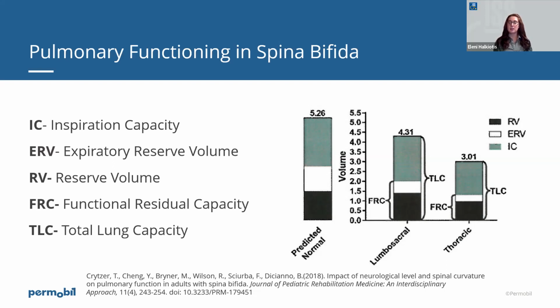But just because the client might not be complaining about it, or to them it might seem normal, or to an OT or PT, where many of us do not have this specialization, I mean, we're not respiratory therapists, they might seem to be doing all right, we still want to make sure that our interventions with configuring wheeled mobility systems that they're going to be sitting in day in and day out can optimize their pulmonary function.